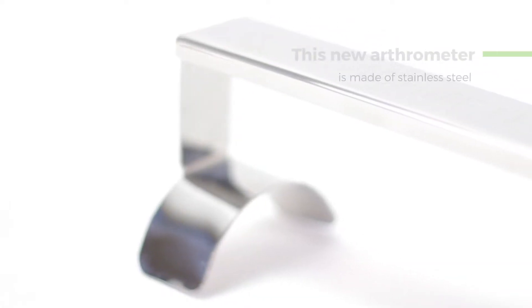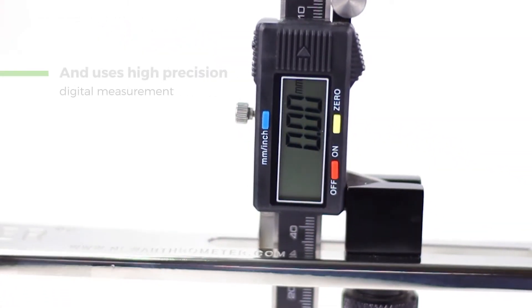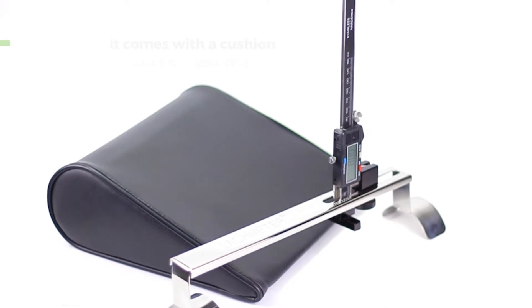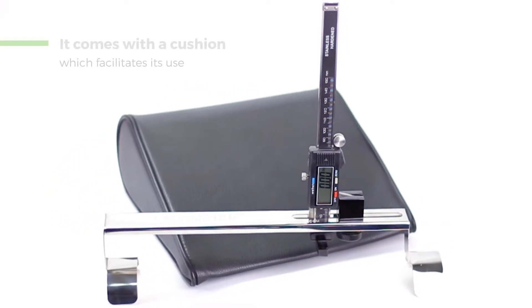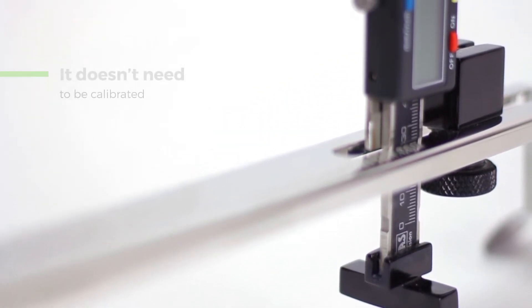This new arthrometer is made of stainless steel and uses high-precision digital measurement. It comes with a cushion to be placed behind the thigh, which facilitates its use. And the best thing is, it doesn't need to be calibrated.